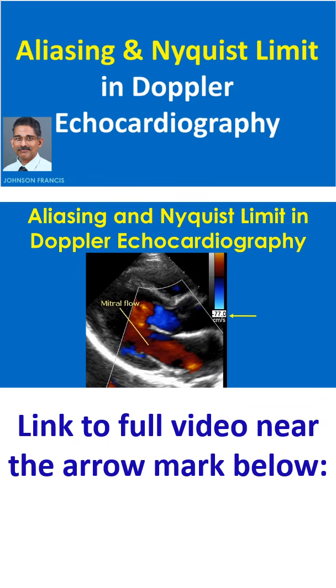Nyquist limit for the flow towards the transducer is not seen in this image as it has been cropped below that level. When the Nyquist limit is exceeded twice, the color again shifts back to the original color. This is known as second wraparound.